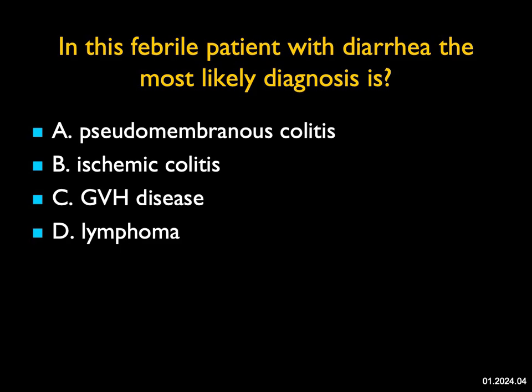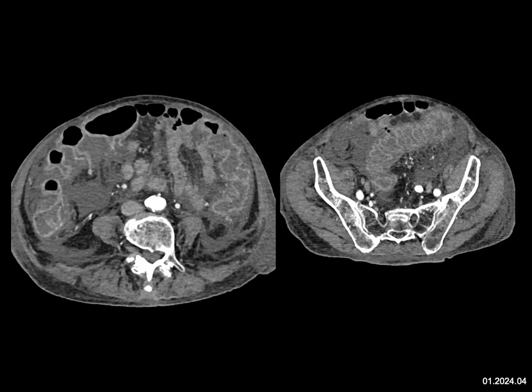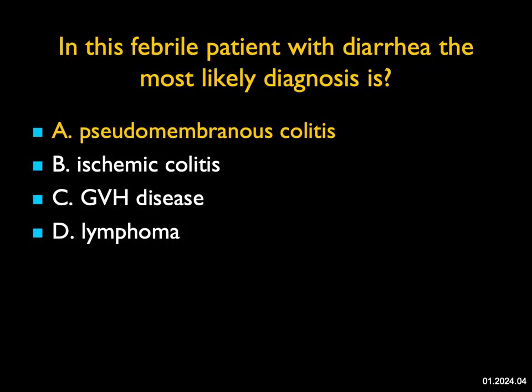In this febrile patient with diarrhea, what's the most likely diagnosis? When you look at the colon, you see the ascending colon, descending colon, and sigmoid colon are all thickened — essentially a pan colitis. Looking particularly at the descending and sigmoid colon, it has an accordion shape classically described in patients with pseudomembranous colitis. Ischemic colitis is possible in theory but too extensive. Graft-versus-host disease usually involves the small bowel with more thickening, and this doesn't look like lymphoma. This is a classic case of pseudomembranous colitis — the patient had previously been on antibiotics, which explains the story.